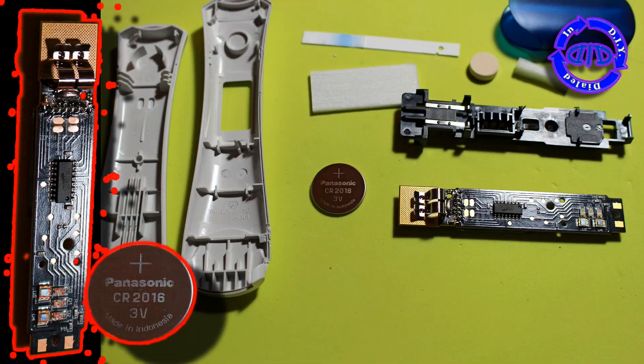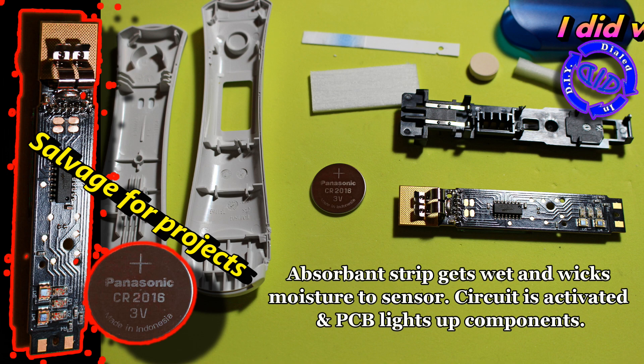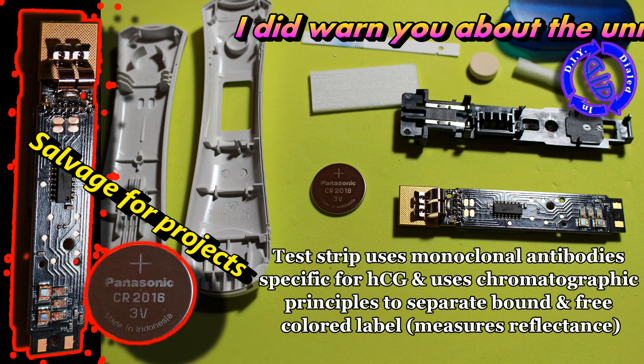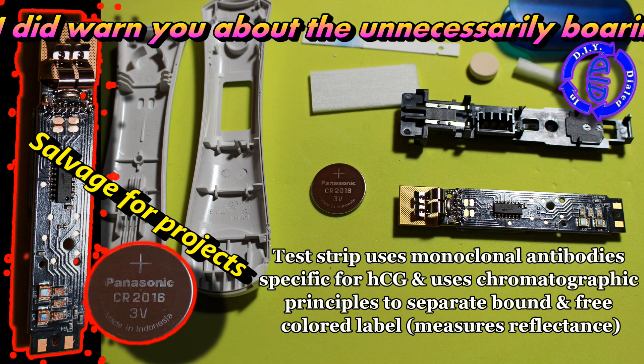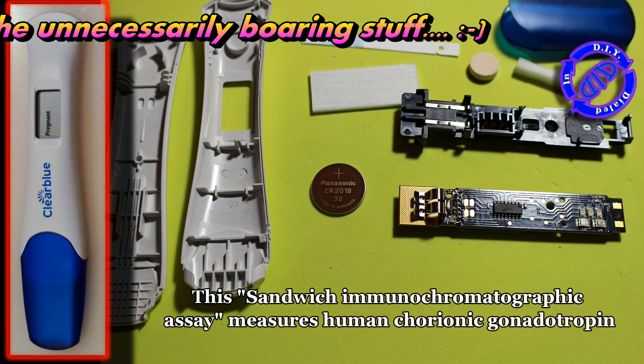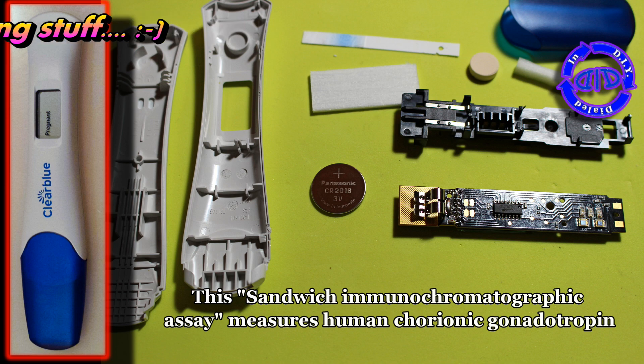Pregnant or not pregnant. I got some fun parts out of this to use in another project, including the battery and the LEDs. The LEDs I just clip off the PCB, and I can actually use the traces to hook them up to wires with a little bit of solder. And now for a nice piece of semi-useless trivia with good word score value: this kind of test is known as a sandwich immunochromatographic assay. Yep, I told you it was a big useless word.